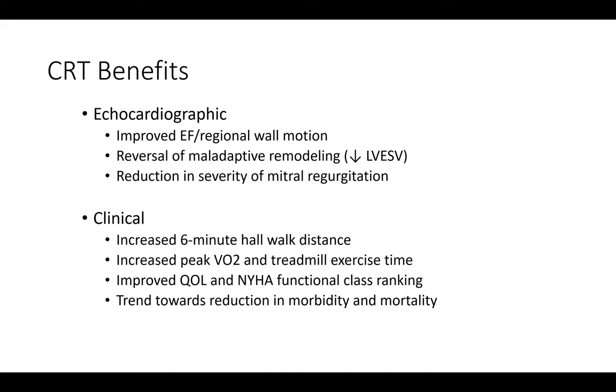In the case we did yesterday, we asked AJ to help us in identifying where each of those leads goes, because we are using a Biotronik lead, bringing it to a Medtronic battery. So we got to a point where, following the Medtronic battery instruction, the Biotronik lead was not entering. I have to call AJ, because if I do something different, I'll have to take that patient back and open that patient up again, which no operator wants. So I had to seek a second opinion, and he bailed us out. Thank you very much for that.